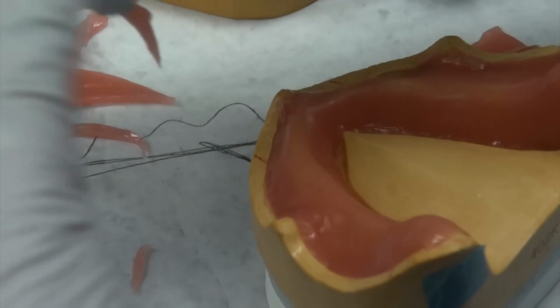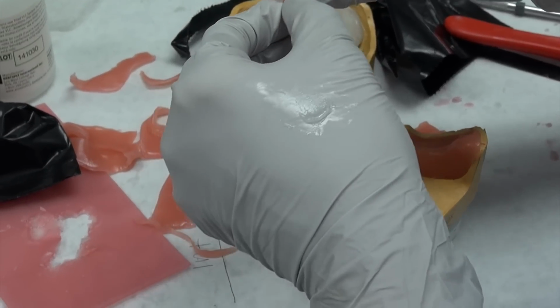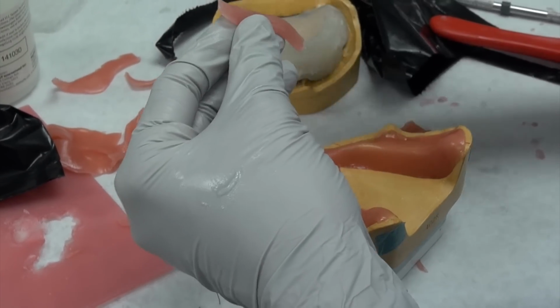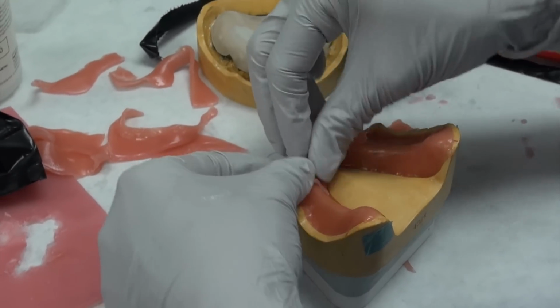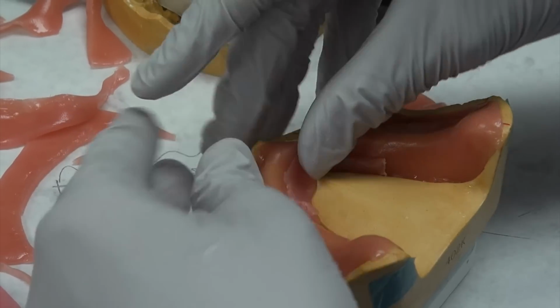Okay. So now we're going to add our second layer. So we're shooting for that 3.5. Okay, just going to add it there.